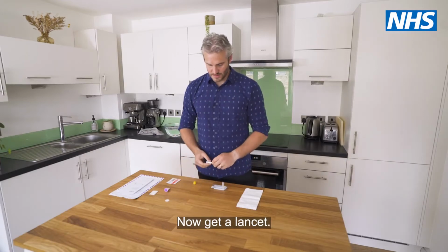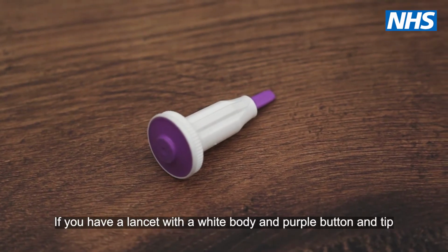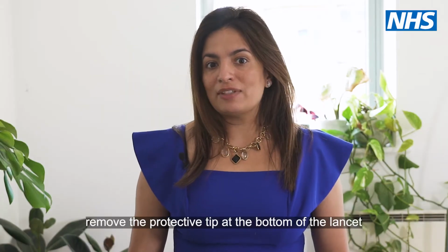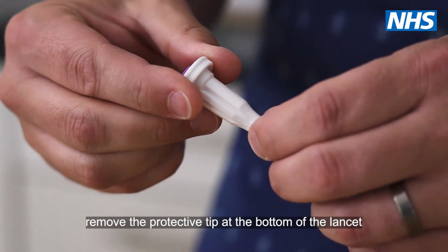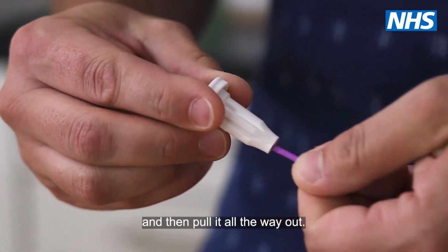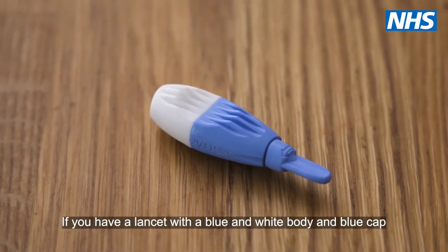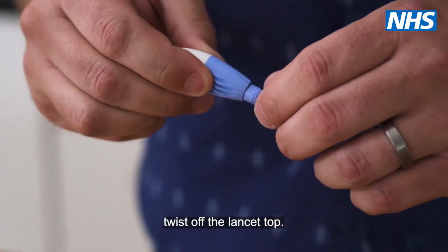Now get a lancet. If you have a lancet with a white body and purple button and tip, remove the protective tip at the bottom of the lancet. Twist the tip 1 full turn and then pull it all the way out. If you have a lancet with a blue and white body and a blue cap, twist off the lancet top.